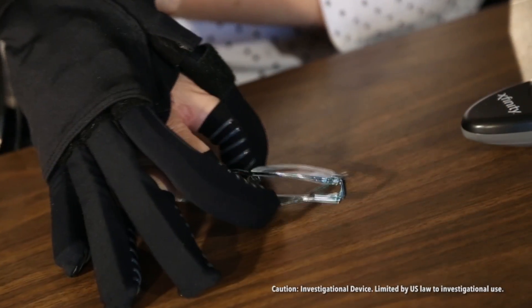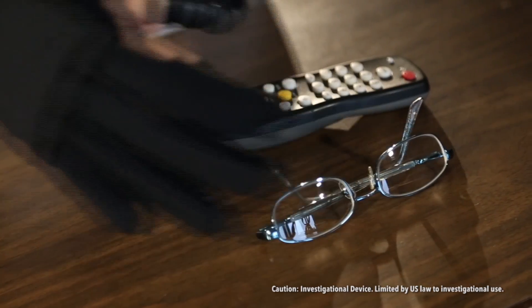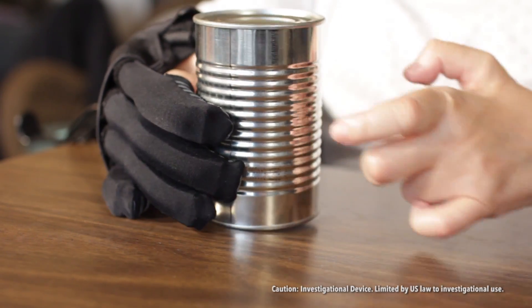I wouldn't attempt to pick these up with my right hand because it's just not strong enough to reliably pick anything up like that. With the glove, it's like having a hand back that works. The soft actuators on this device act as an extra muscle layer, riding on the back of the finger, and provide the extra force a finger needs to close around an object.